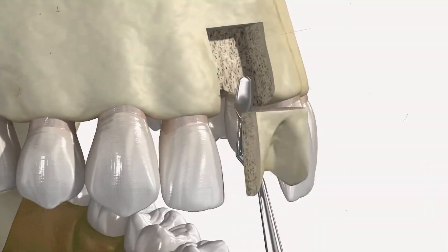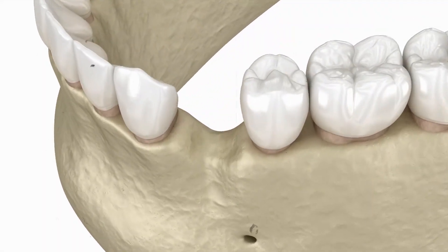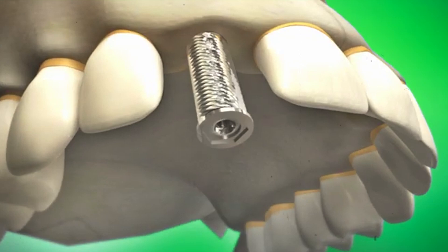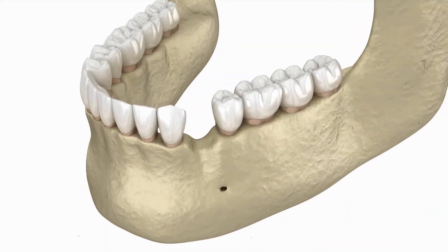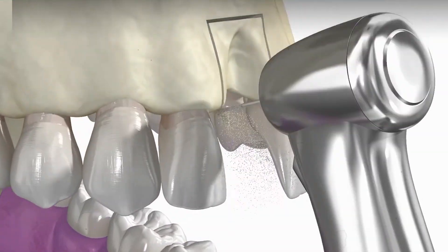A dental bone graft, also known as a jawbone graft, is a surgical procedure where missing or weak bone in your jaw is replaced with new bone. This procedure is often done to prepare for dental implants, but can also be used to fill the empty socket after a tooth extraction. Let's take a closer look at this procedure.